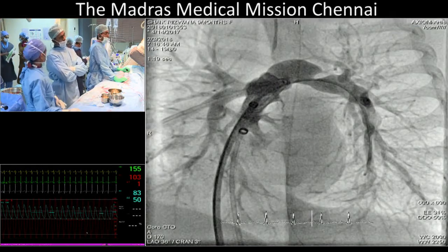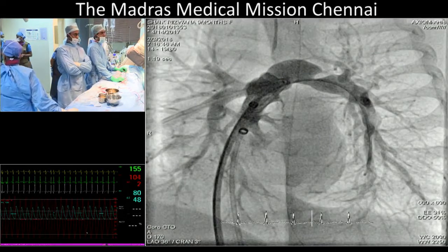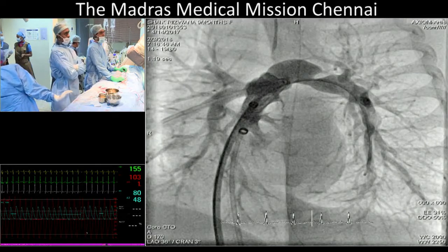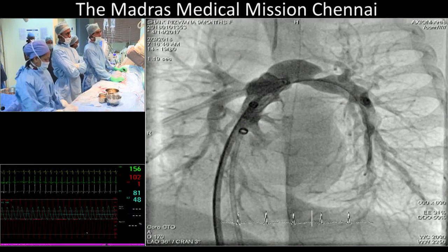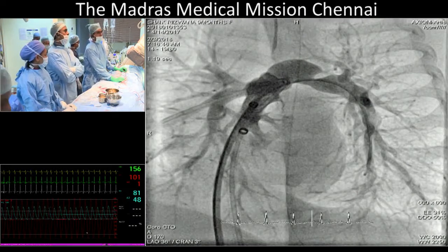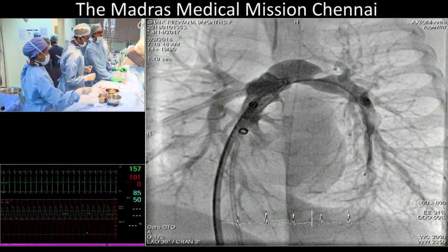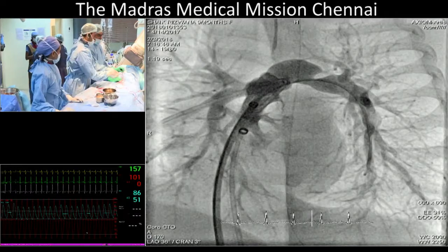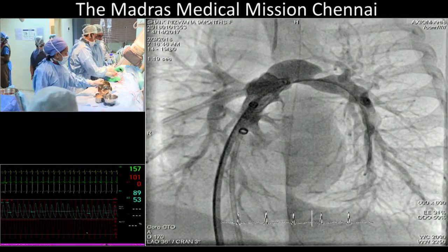Okay, so Alison, what to do now? The origin of the LPA, is it a little bit better, or not? Not better. No. Now the RV is suprasystemic. Yes, so we have more of a problem perhaps than we started with. Can you stent that one open and leave the RPA alone? This is just not a movable membrane, perhaps.